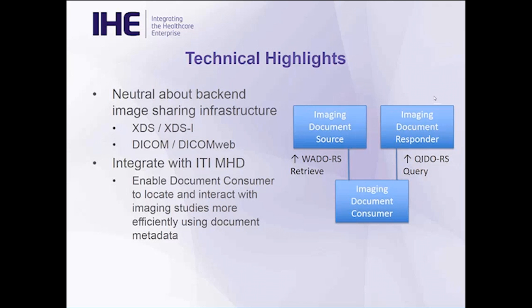This profile also will have the ability to integrate with the ITI MHD, or Mobile Access to Health Documents, profile. In particular, when the MHD document consumer identifies a manifest or imaging study, it can then use this profile to locate and interact with the imaging study more efficiently using some of the metadata provided by the document consumer in MHD.